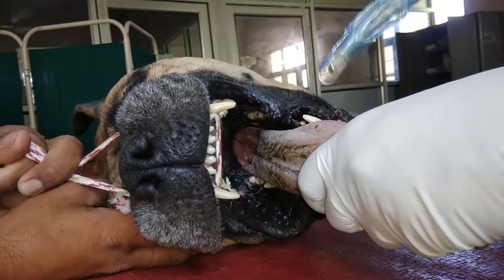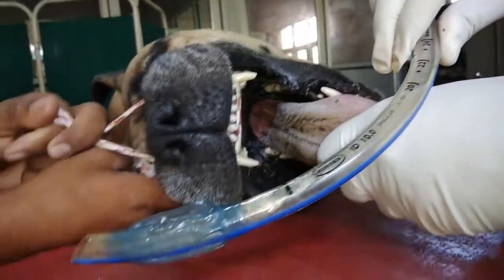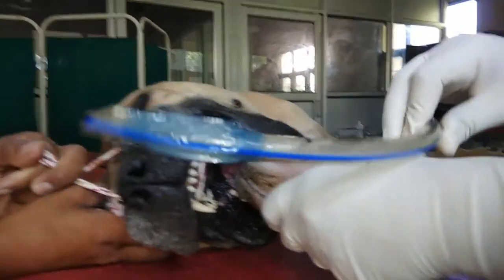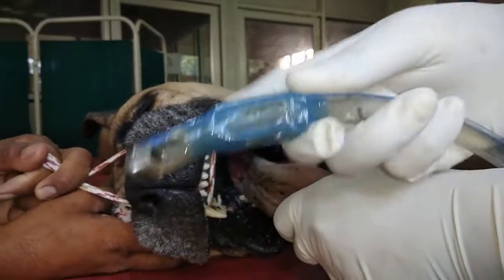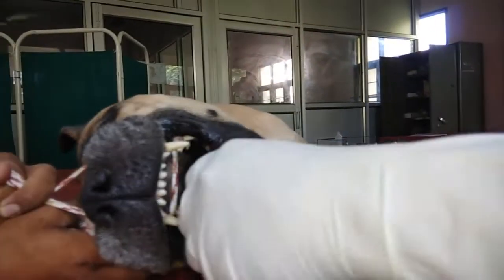For intubation of this dog, we select a 10 mm internal diameter curved endotracheal tube. We have already applied lignocaine jelly at the tip and at the balloon.